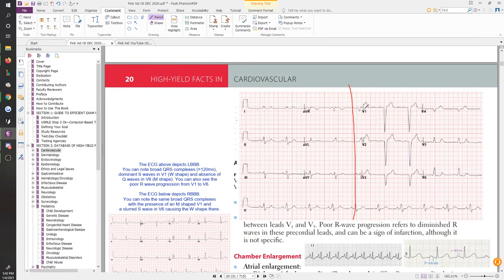Compared to our normal guy, which just had a tiny hill here, we've got quite a weird thing happening here. We have this first guy that's pointing up, and then all of these guys are pointing down. V1 was supposed to point down only a tiny bit. Remember, AVR and V1 are the only two guys that point down, and it was supposed to be a tiny hill, not such a big one. So already I'm not seeing an R wave progression. Something is definitely wrong. And then we start evaluating it.